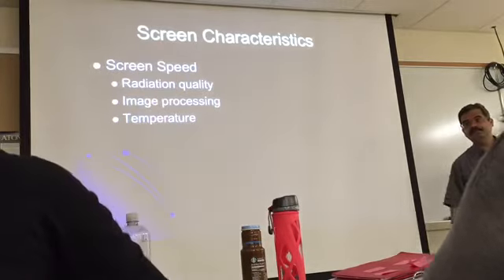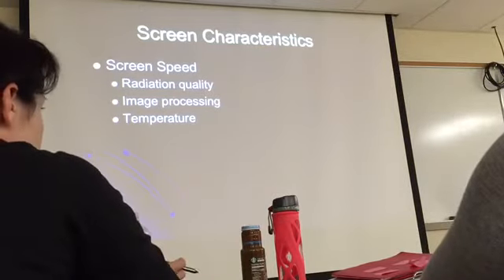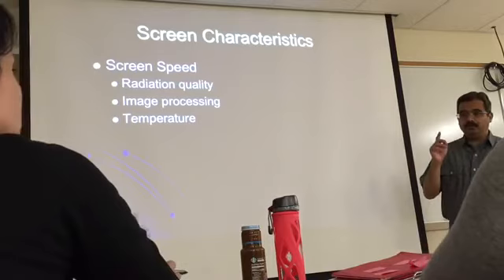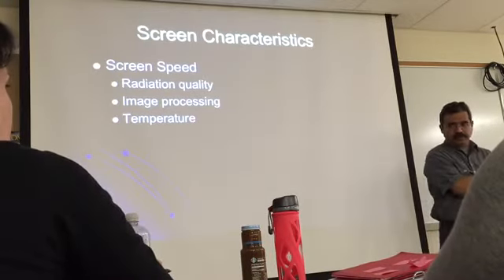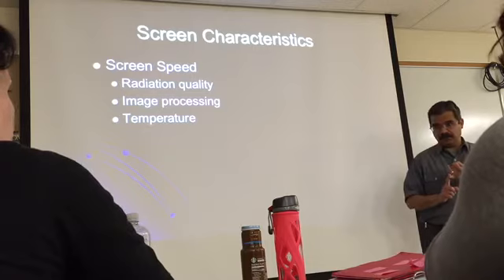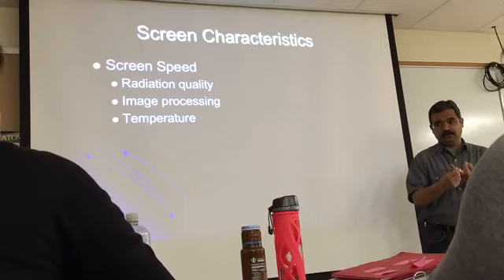So, I'm sorry, did you say there are two different intensifying screens for mammo and regular X-rays, and there are also two different films? No. Only two different screens? What I said is for mammo, you use one type of screen and one type of film, and they were separate. And now for every other type of work you did, you had the same film and then two screens. One slow screen, one high speed screen. And that was it.